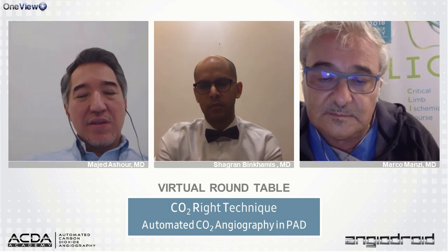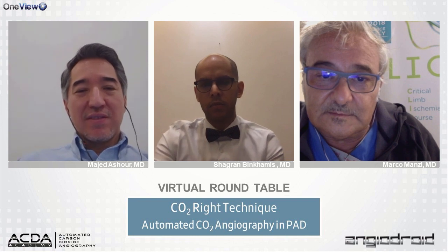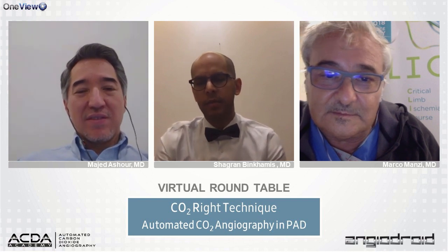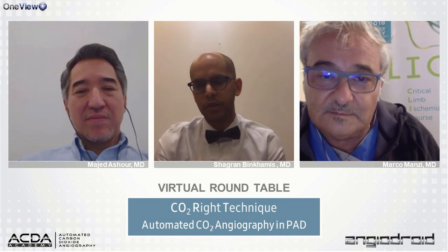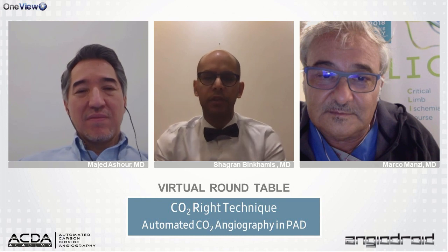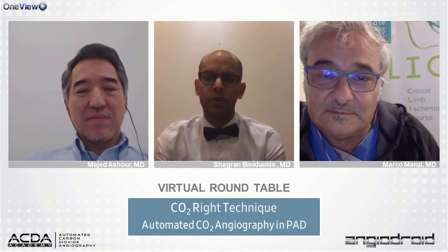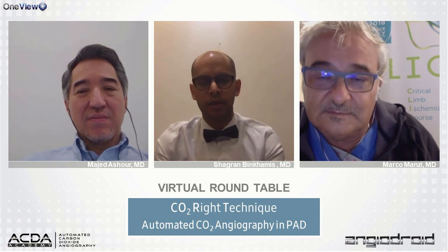Very good. Dr. Shagran, any experience with this? No, we haven't had a specific patient that needed angiogram. We've done a few COVID patients for other procedures, but I think the same rule applies as for patients with pulmonary insufficiency, that the main rule is just to wait in between, just like Marco said. Nothing. I have nothing to add.